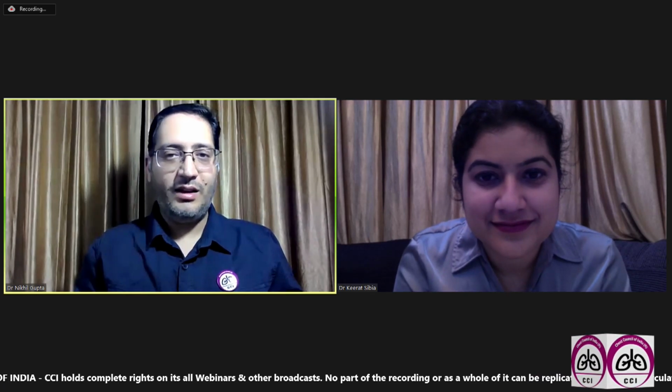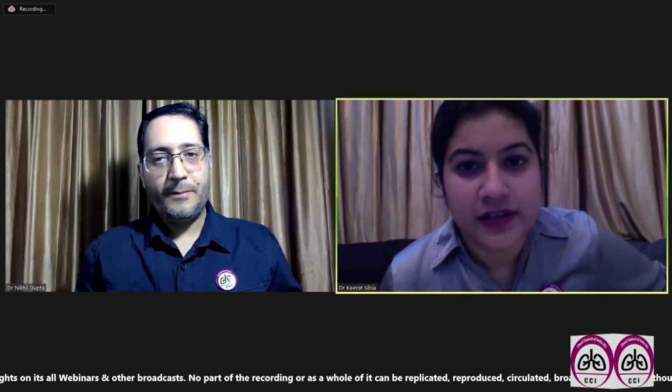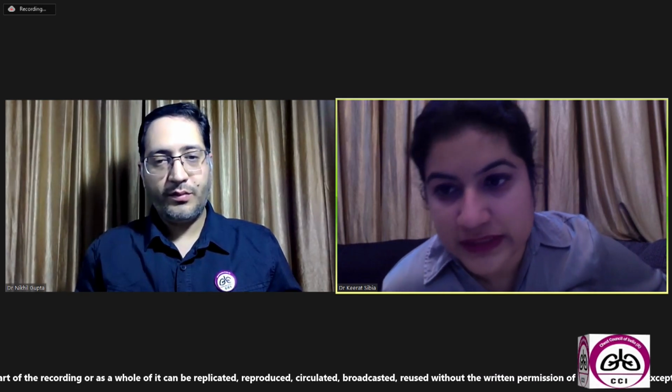I would like you to answer this question from Dr. C. Mohan Rao from Odisha, from Bhubaneswar. Good evening, Dr. Rao. His question is, what are the reasons for bilateral volume loss in chest X-ray? I think the most common would be an expiratory film. And atelectasis, bilateral basal atelectasis. ILD cases, perhaps. And again, if bilateral, then we expect it to be symmetrical, right? Certain restrictive lung diseases. My vote would be that the most common would be an expiratory film.